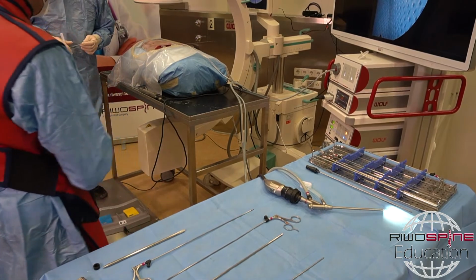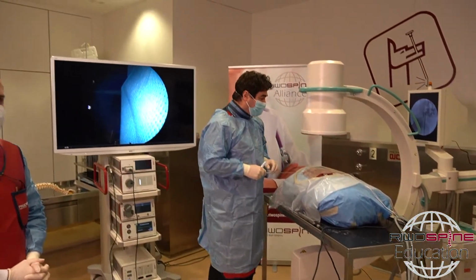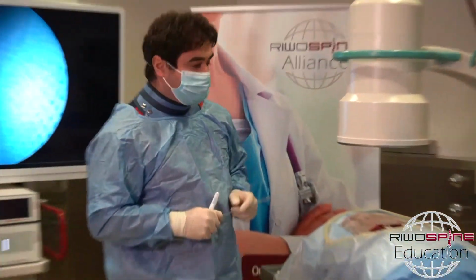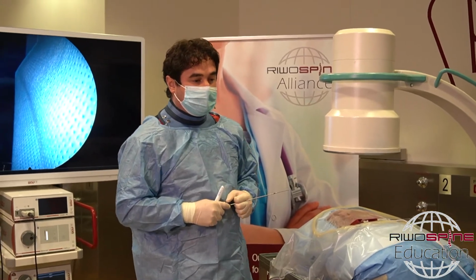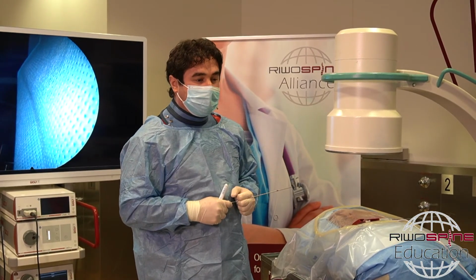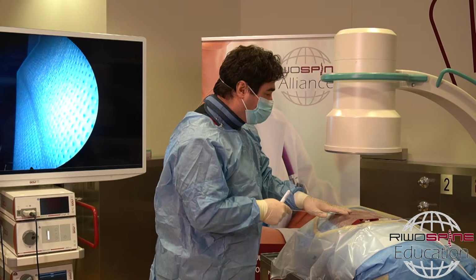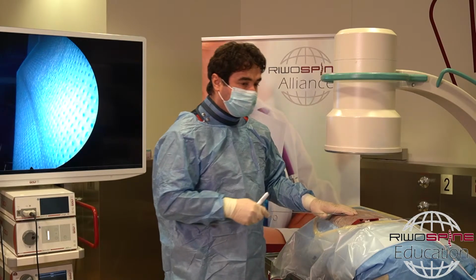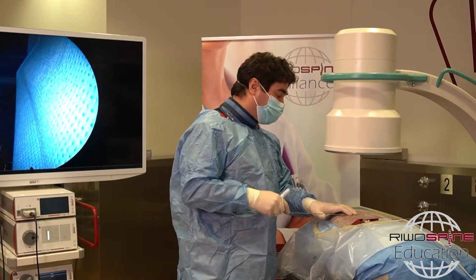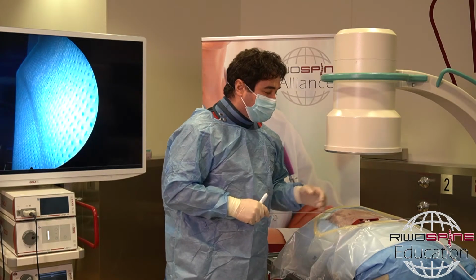Dr. Yarokoglu. Okay, welcome everyone from my side. I'm going to demonstrate today how we can reach the far caudal side of the level. As you know, we prefer to do it with the interlaminar approach. The reason for that I'm going to tell during the demonstration. We start with straight AP.